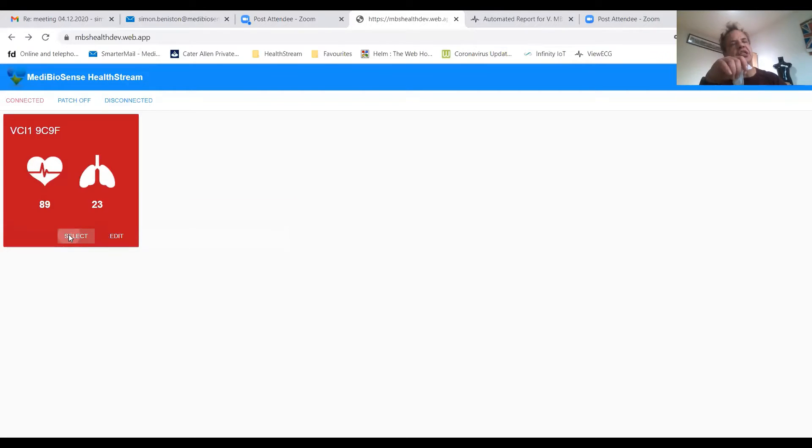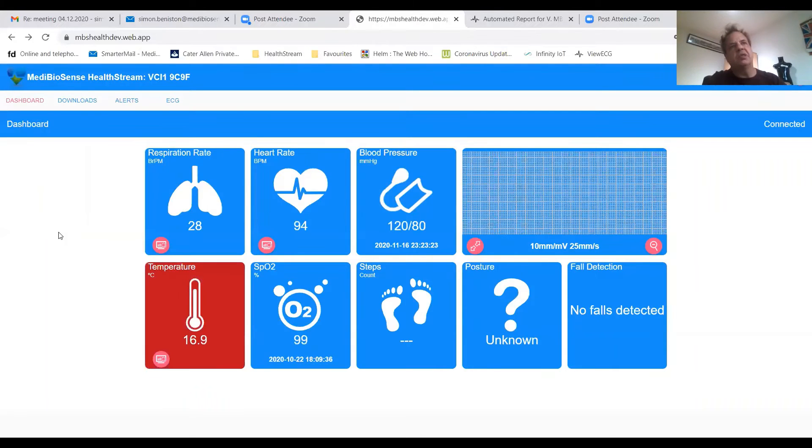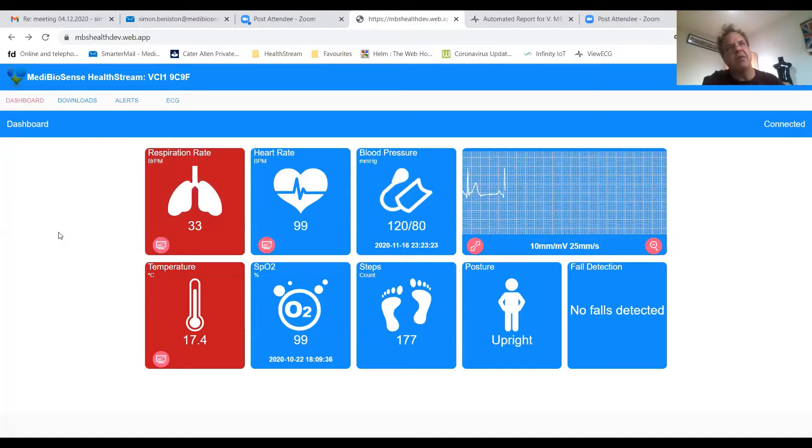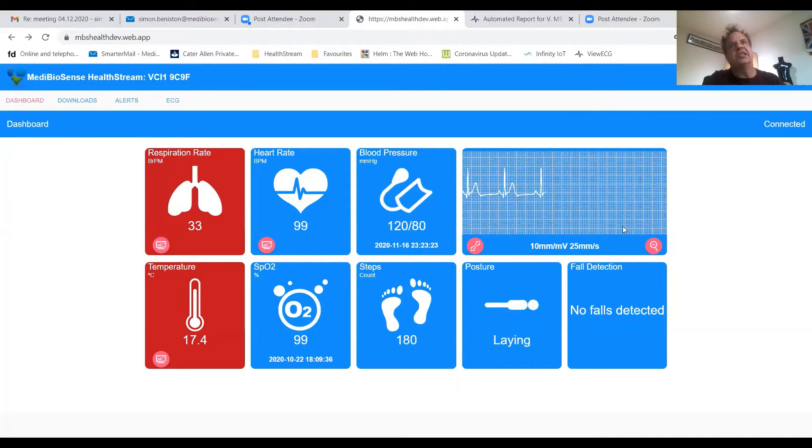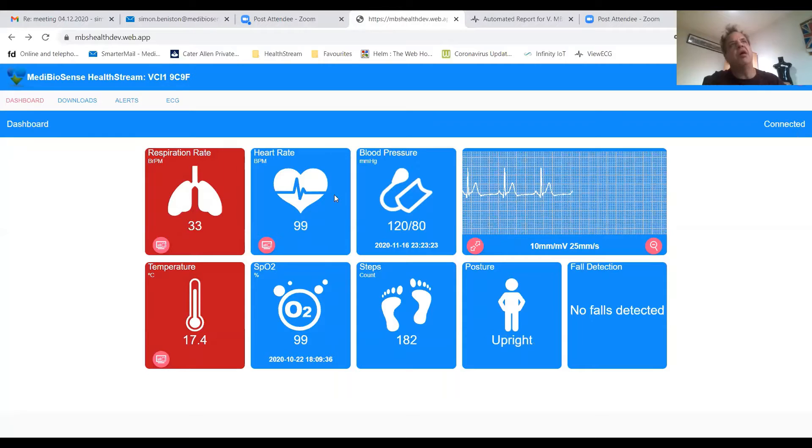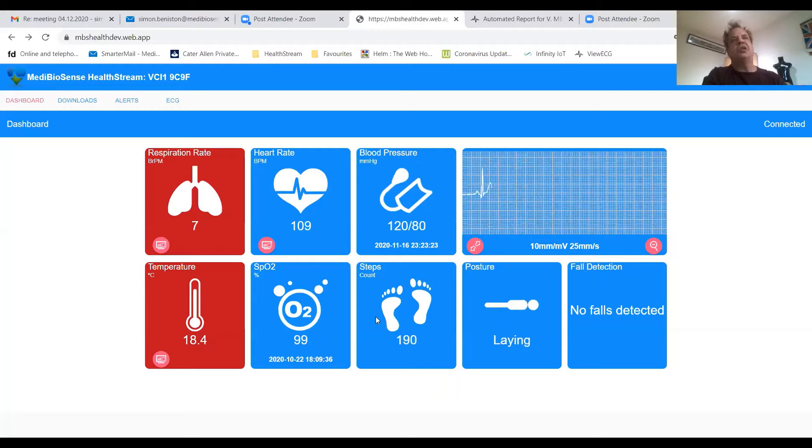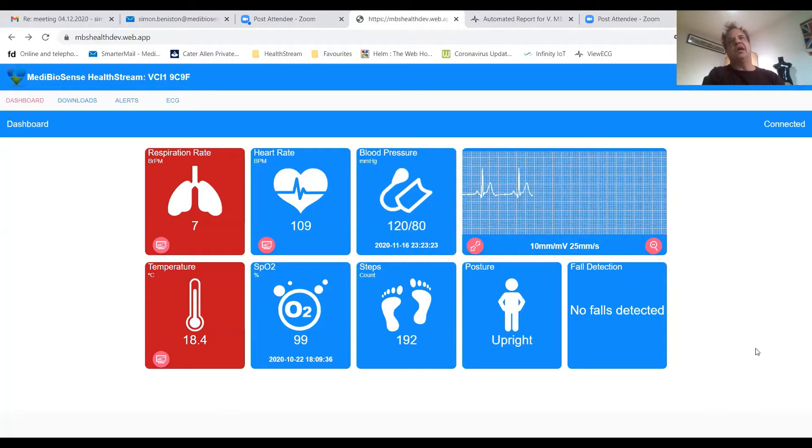If I select the patch, this is live data you can see via any browser remotely. You start to see live ECG, blood pressure, heart rate, respiration rate which is in alarm, temperature, oxygen levels, steps, posture, and fall detection.